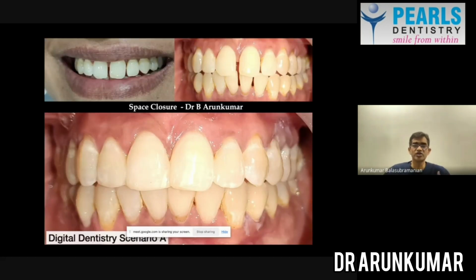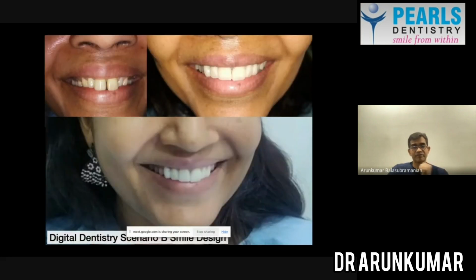If you look at it, I can show you some actual patient clinical scenarios where we can use digital dentistry. For example, in this particular case, we have used digital dentistry to close the spaces between the teeth. The patient was not happy with the spacing that is present between the teeth. So we have used veneers to close the space so the tooth will look as natural as possible.